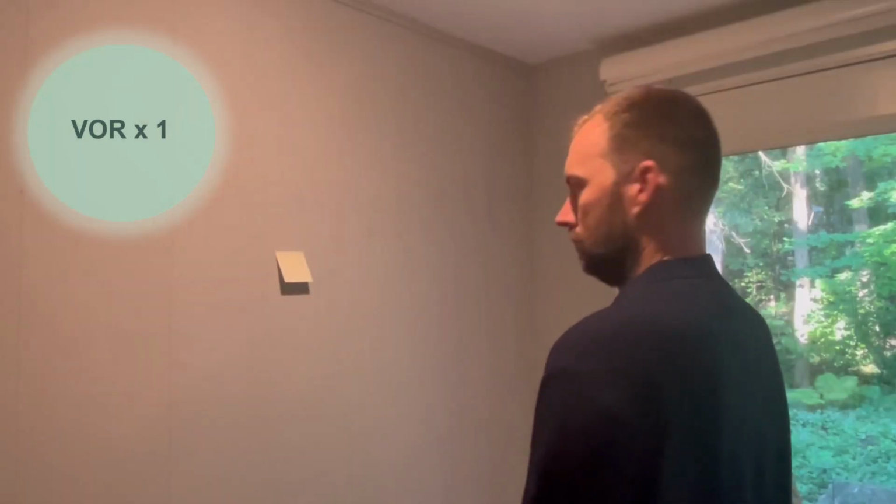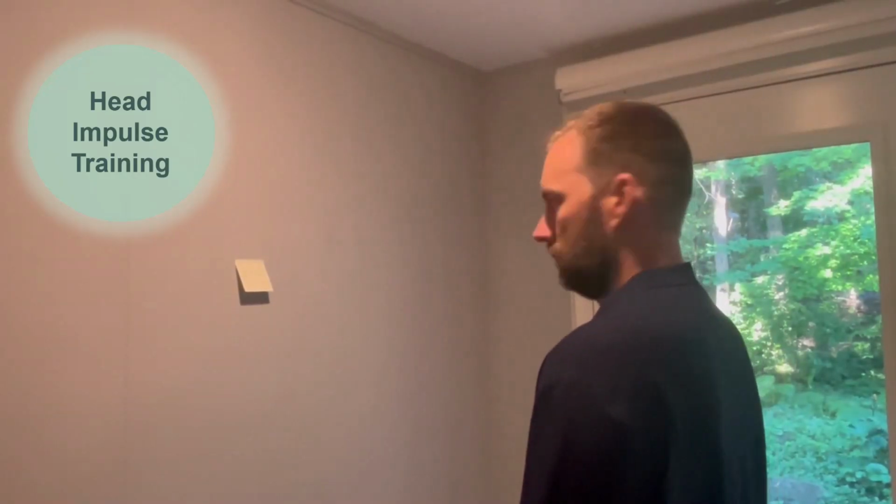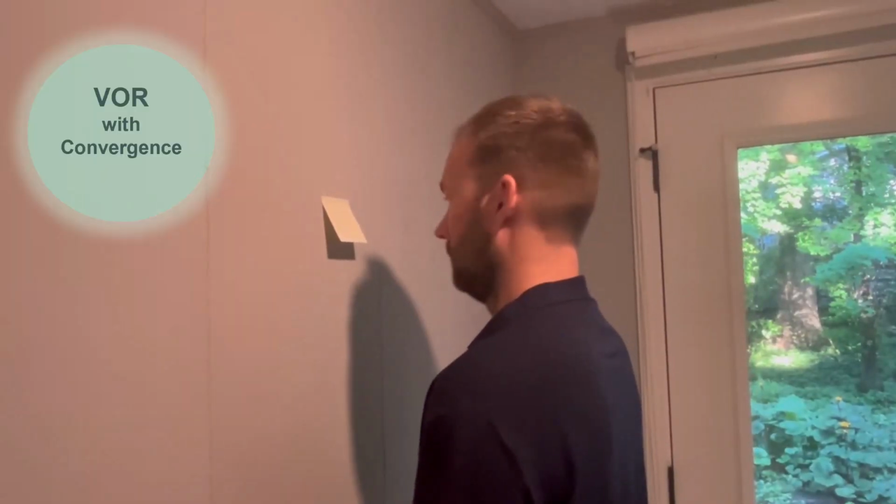So there are 4 main types of gaze stabilization or VOR training exercises: VOR ×1, VOR ×2, head impulse type training, as well as VOR with convergence. Most of us are really familiar with VOR ×1 and VOR ×2. They're well supported in the literature and have been around for a long time. We know if our patients perform those, it'll reduce their visual blurring symptoms and their function will improve.